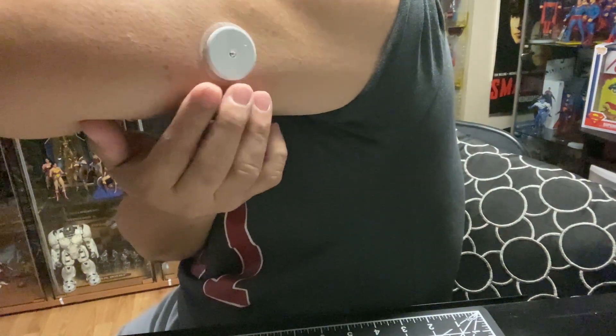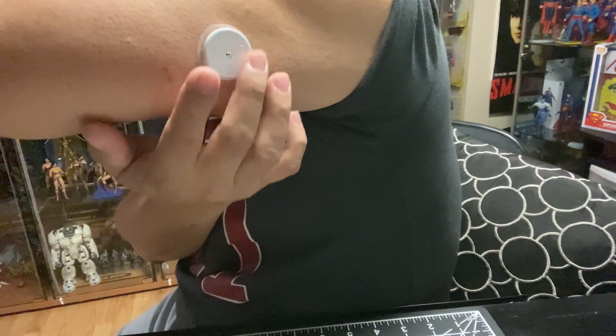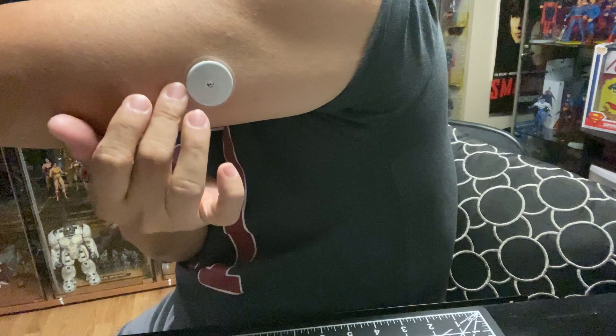Just work around the edges of the sensor and make sure the sticky part is flush to the skin.